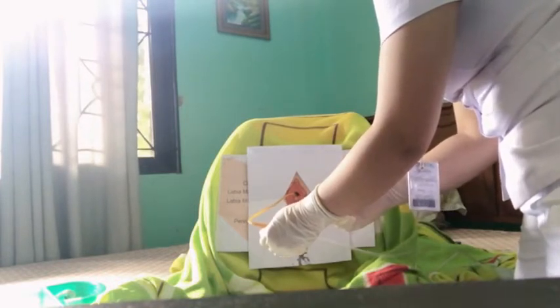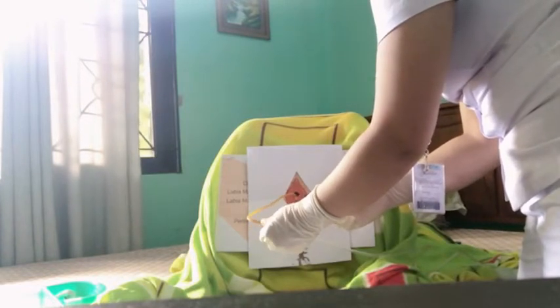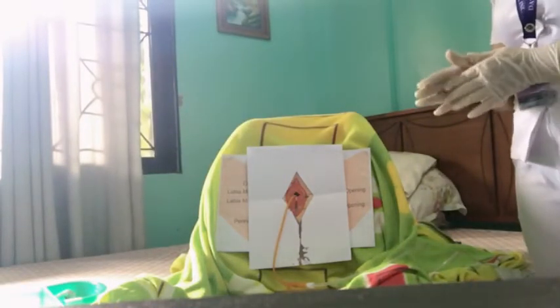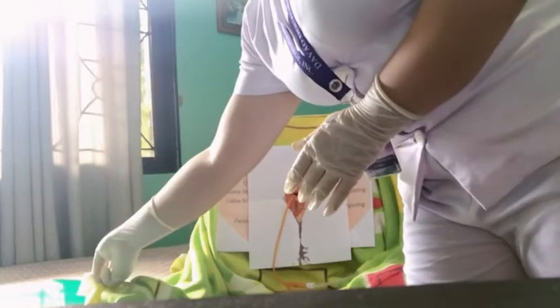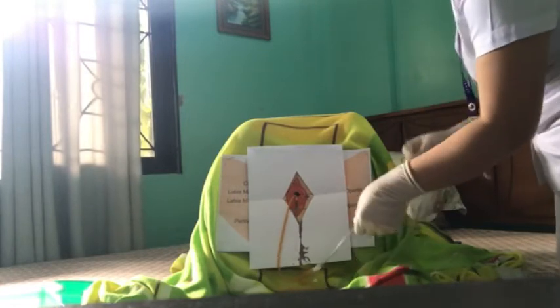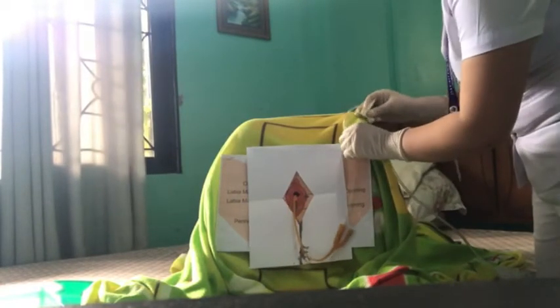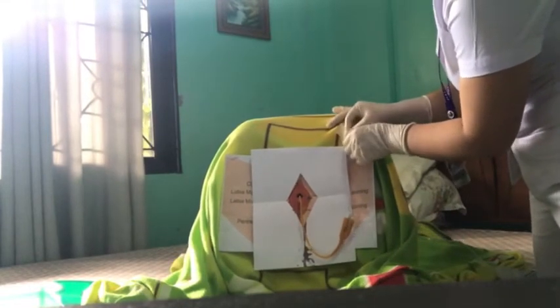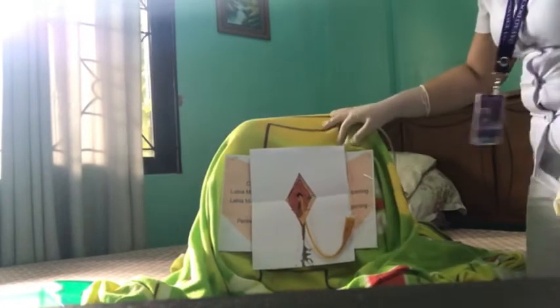Okay. Withdraw the needle. Then place it in the receptacle area. So we have our receptacle here. Secure the indwelling catheter by taping it to the patient's thigh using the catheter tape. Allow some slack of the tubing to accommodate the patient's movement. Assuming that this is our thigh, properly securing the catheter will prevent tension in the catheter when the patient moves.